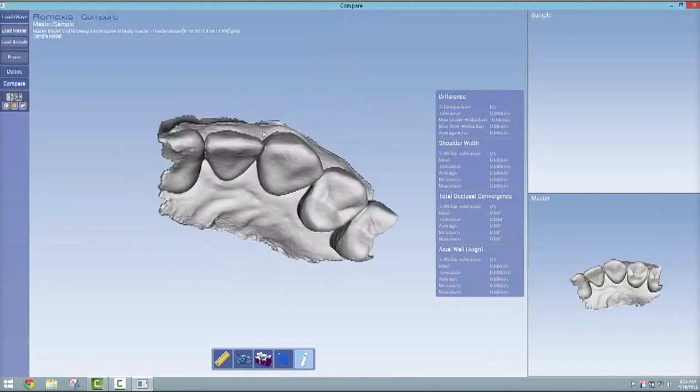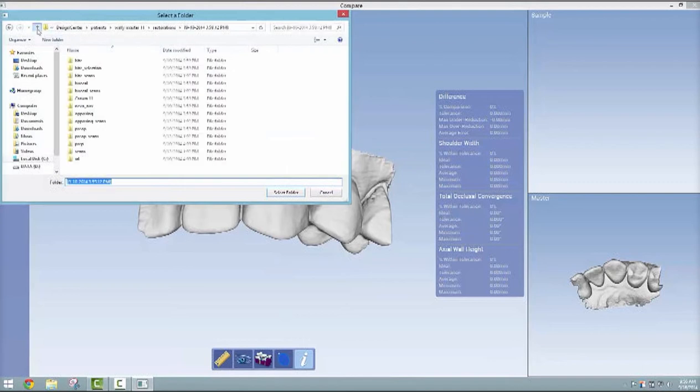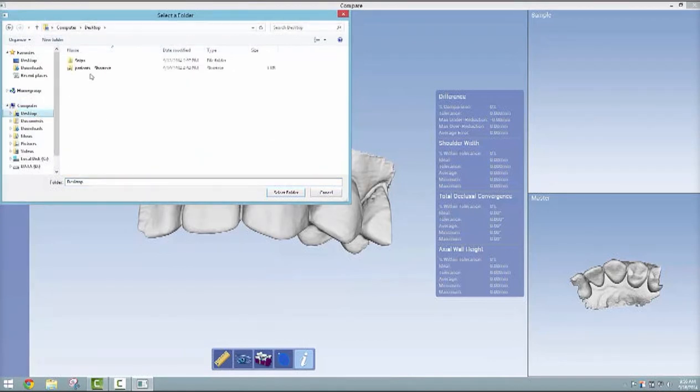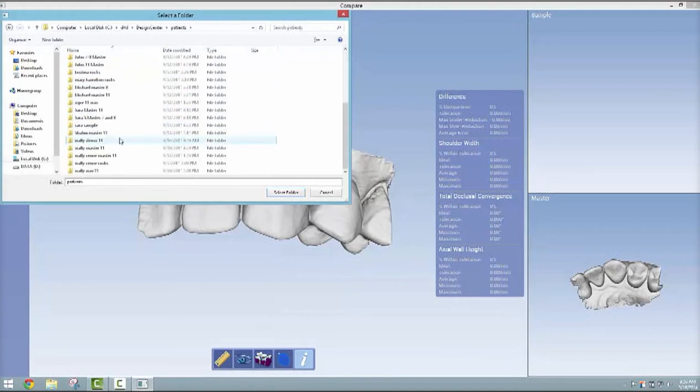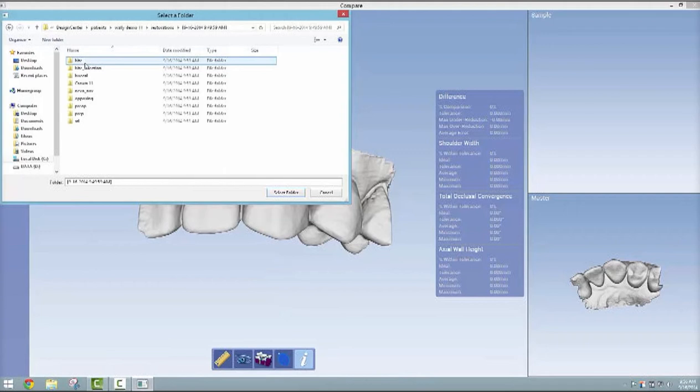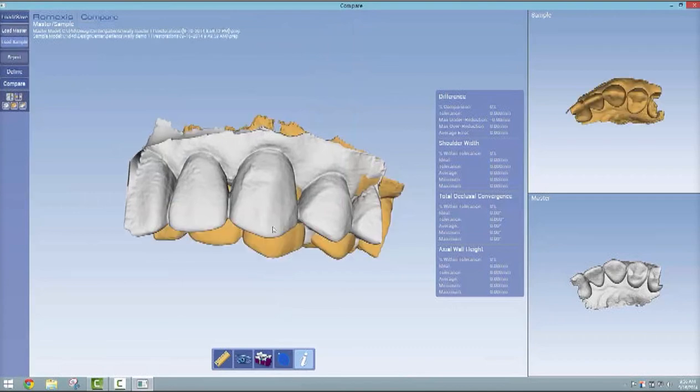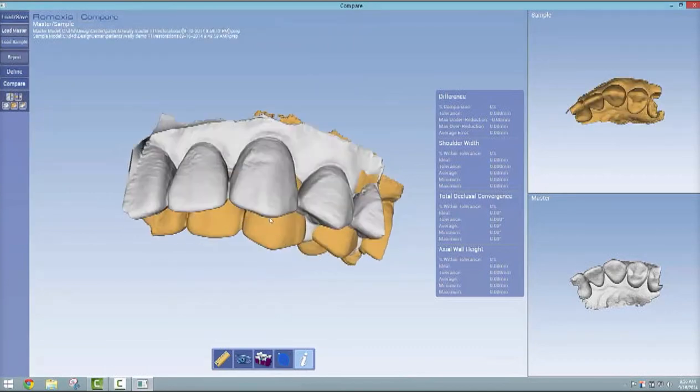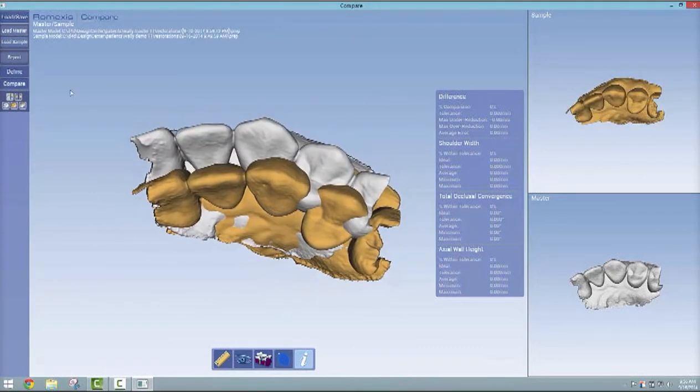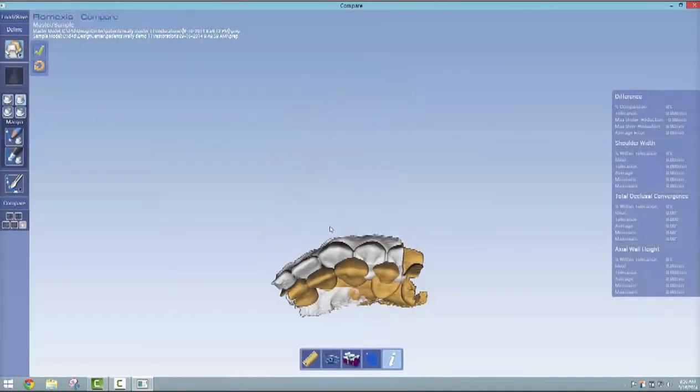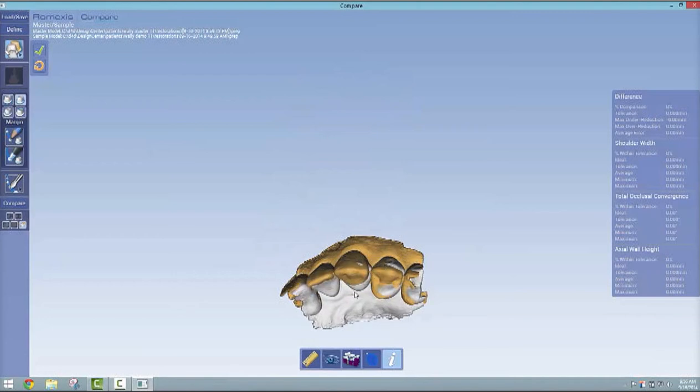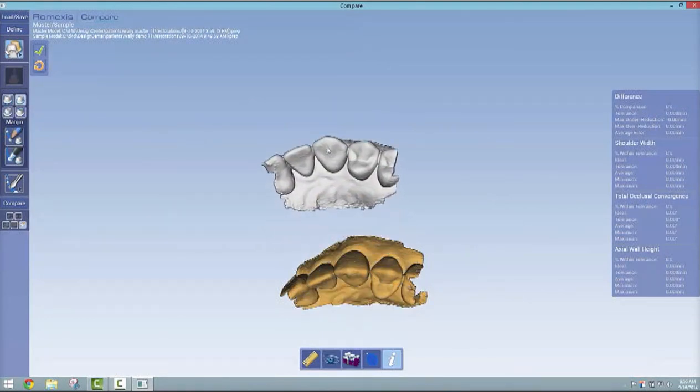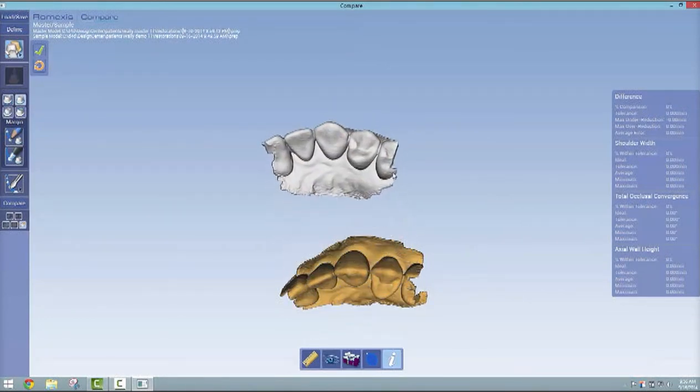Here we've loaded the master for that number 11. Then likewise, you go to your desktop, find the patients folder, and find the tooth you're wishing to evaluate under the sample. Once again, navigate through subfolders until you get to the prep folder. It's either going to automatically align those or it's not. If it doesn't, you just go to the define tab, click the drag icon, and get them in the ballpark.